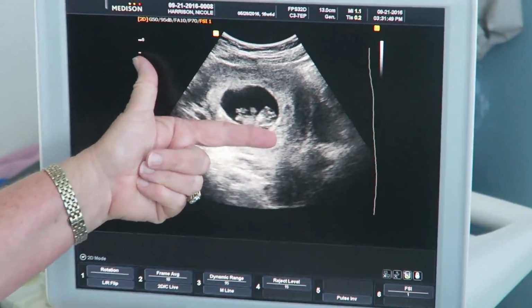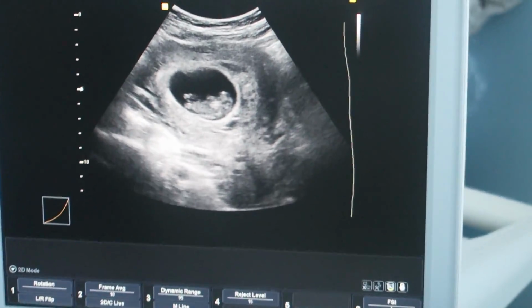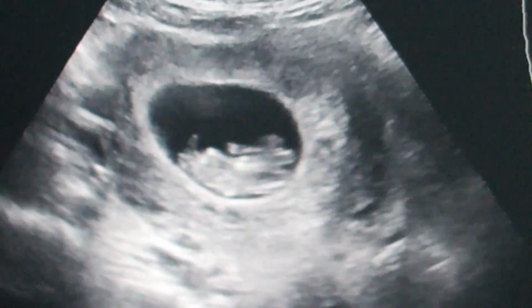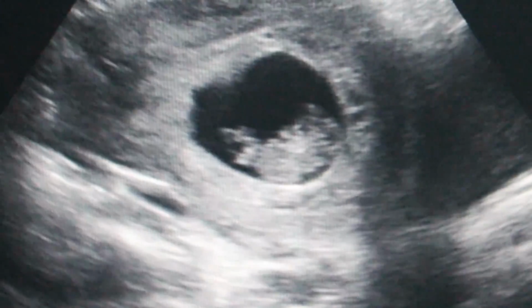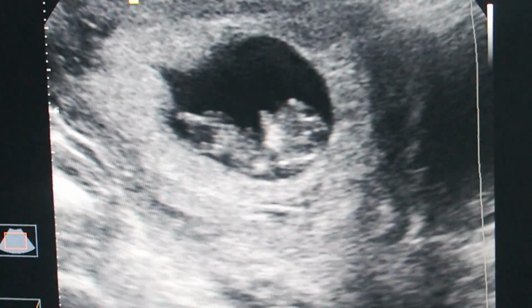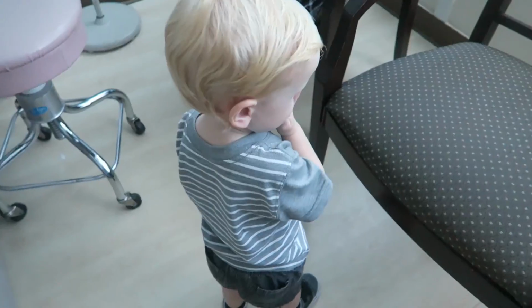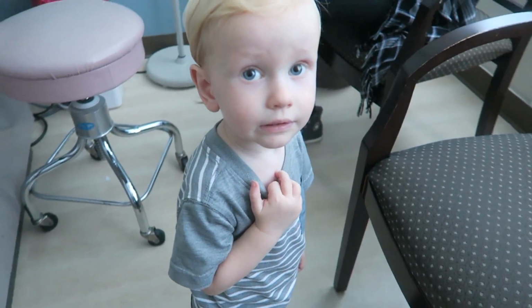You can see, yeah. What would be that big? Wow. Tiny little hands and feet there. Yep. At this point, we just call them extremity buds. They're there. Are they just little webs? Well, they start off as little buds and they go out. The fingers and the feet are still kind of webbed, but it's just too small detail to see on the picture.